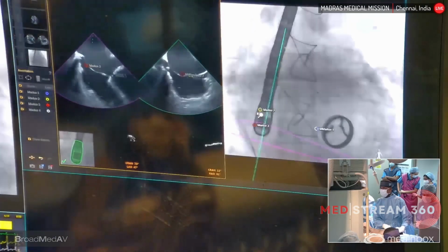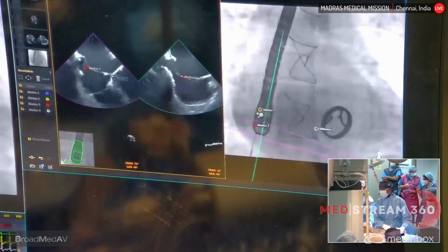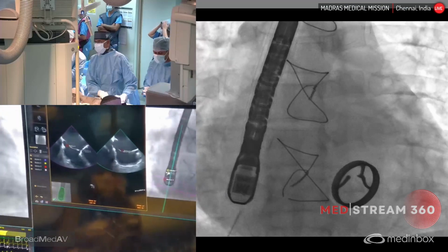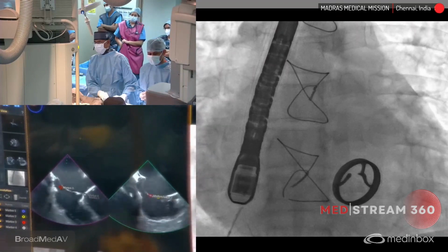I want to direct it a little posteriorly. It's going too posterior. I'm reaching the target. I'm indenting the septum. I'm very posterior and I'm very inferior. We can appreciate that I'm very inferior. Can you show the tip of the needle on X plane also, Srija? I'm seeing it on the Y plane, X plane also.